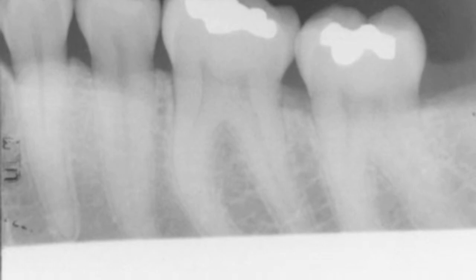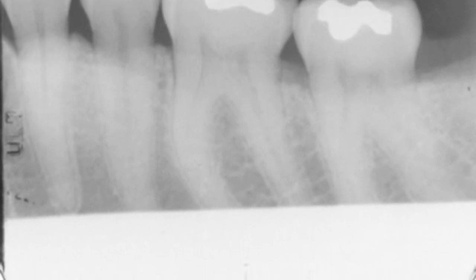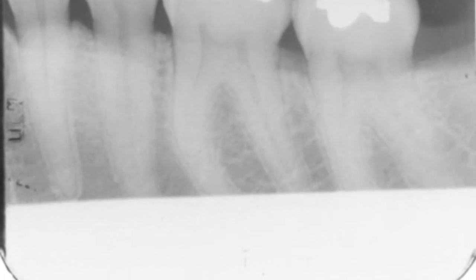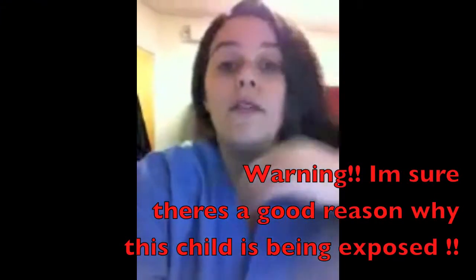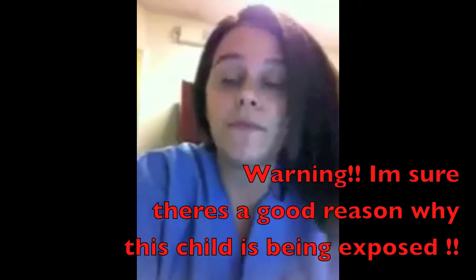However, many practices have not adopted the use of rectangular collimators due to increased errors in taking films, not properly aligning the device with the film and having cone cut and things like that, which obviously does lead to retakes and more exposure. There are many benefits to using them other than just reduction in radiation exposure.